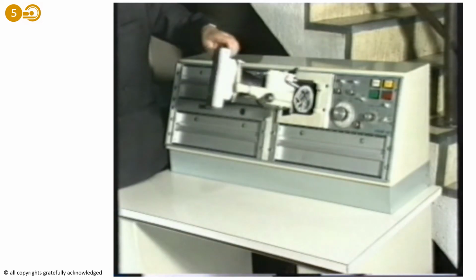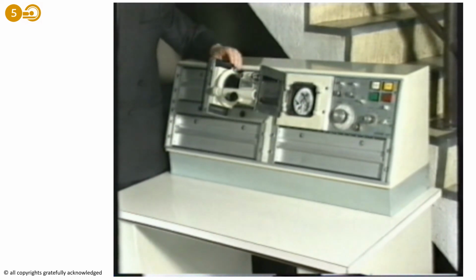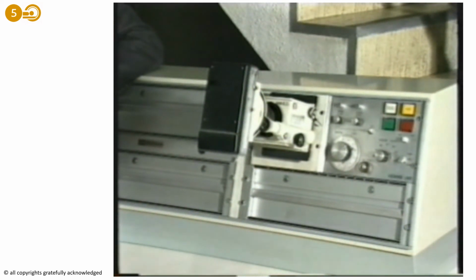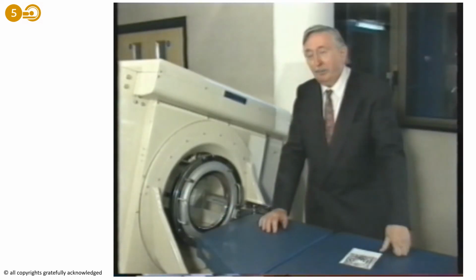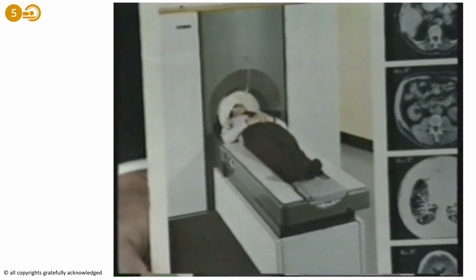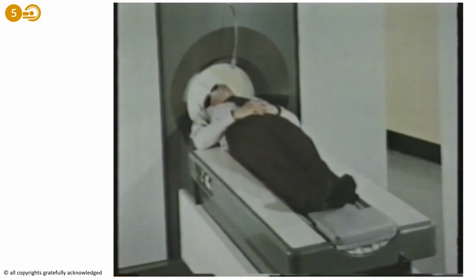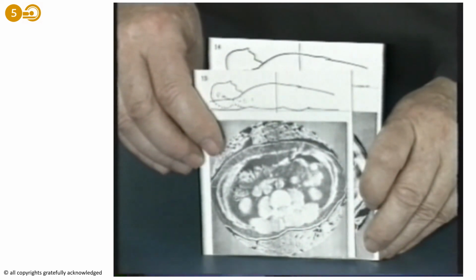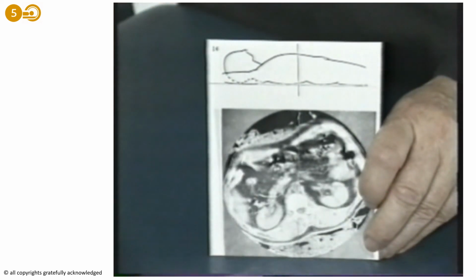The picture could then be processed within the time of one patient being scanned, and it was recorded on Polaroid film. The success of the brain scanner led on to the production of a whole body scanner. I was very pleased when it took a very handsome picture of myself when it was tested in the laboratory for the first time. Although a little slow, 18 seconds to take a picture, the clinical results were accepted by all with enthusiasm.